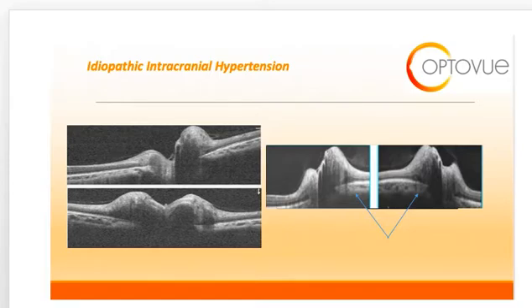This is another slide of disc edema as a result of idiopathic intracranial hypertension. On the left-hand side, you can see the smooth internal contour that we discussed in previous slides. On the right-hand side, you can see what we call an inward angulation of the peripapillary RPE Bruch's membrane layer, as illustrated by the blue arrows. This inward angulation does not occur in other causes of disc edema.